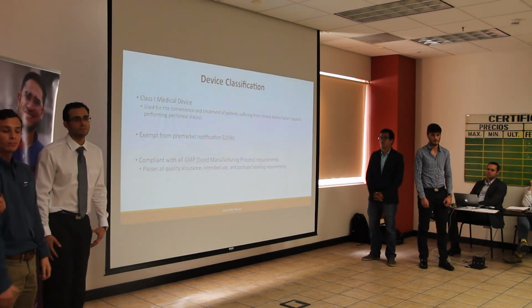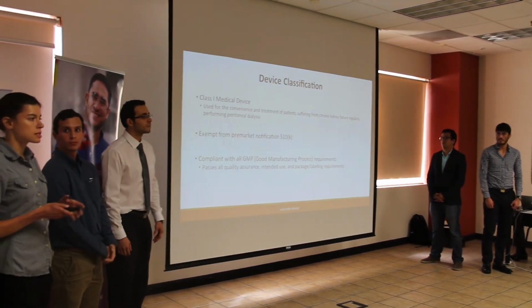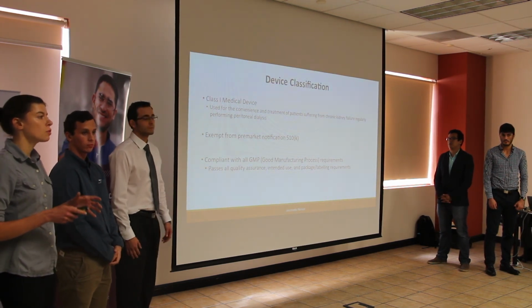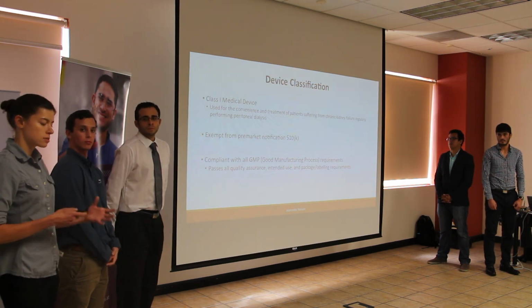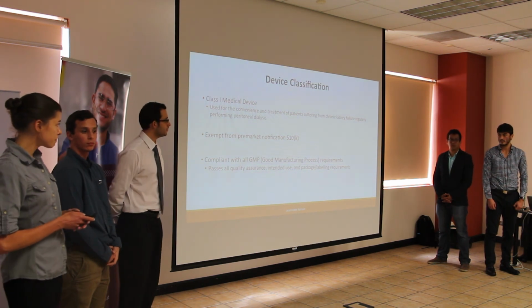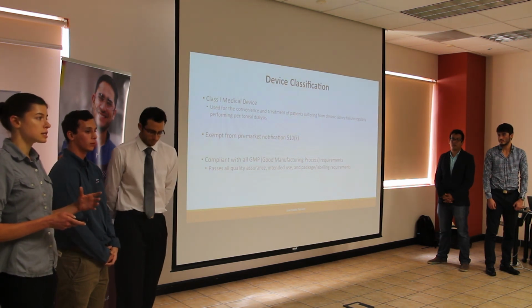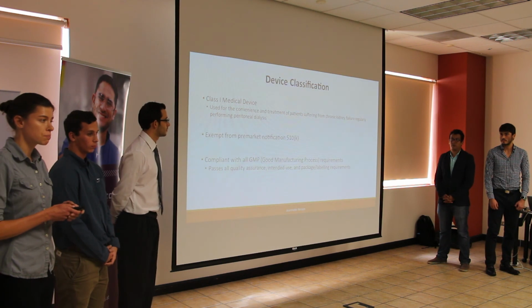We decided to classify our device as a Class 1 medical device. What this means is it is specifically for peritoneal dialysis. It is used for a medical purpose, but it poses no great risk to the patient. If it breaks, it likely won't cause any lasting harm or injury. Because it is a Class 1 medical device, we do not need to go through certain FDA testing, including the 510(k), like other medical devices have to do.